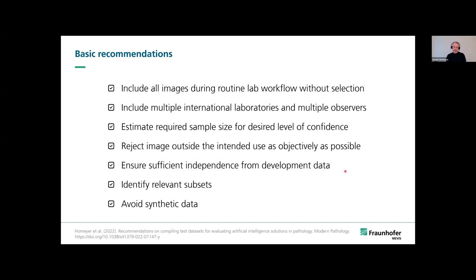We also think that it's important to ensure sufficient independence from development data, because to detect problems with overfitting or shortcut learning, it's very important that test data sets are independent from the data sets used in the development of AI solutions. It is not simply enough to use other images, but test data sets should originate from different clinical sites.